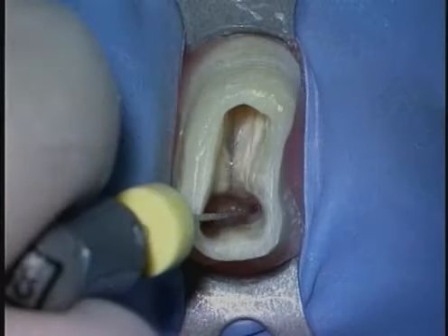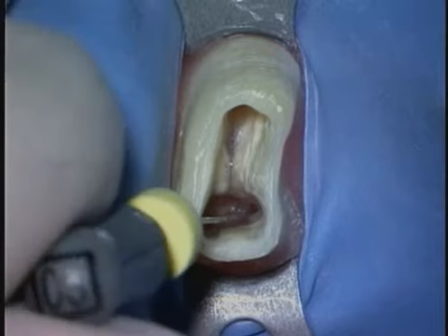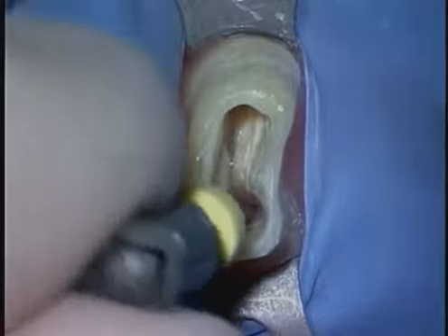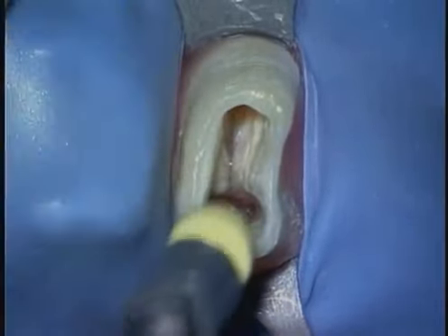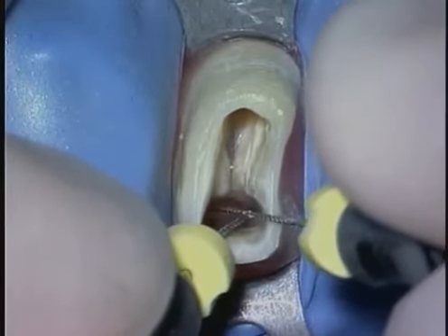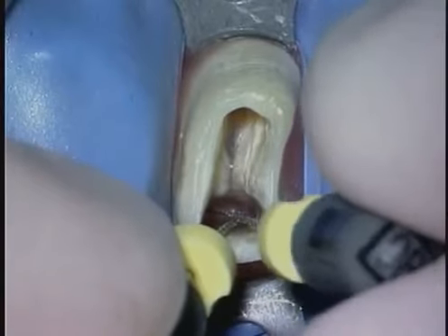With the bridge removed, the tooth isolated, and the access preparation completed, you can visualize the smaller and slightly displaced MB and DB orifices. Small handle reciprocation moves the file in, and handle flutter suggests the tip of the file is beginning to bite and track the canal. Clinically, I would want viscous chelator in the chamber to act as a lubricant, which would help the file slip and slide deeper into the canal.